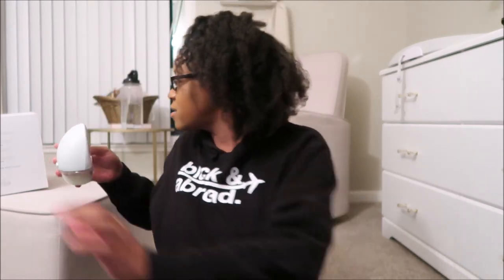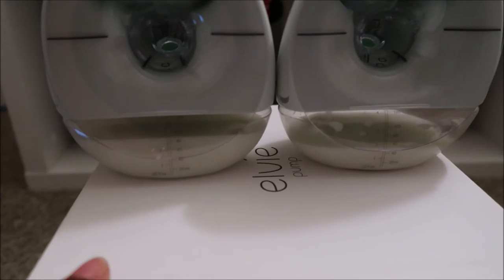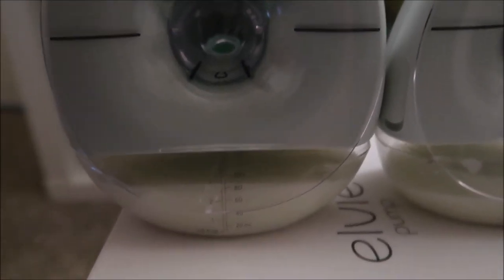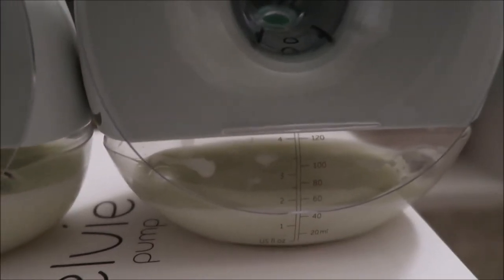I want to look and see if it was accurate — I'll set this flat. Actually a little off, which is interesting. This was on my right side and this is my left side. As you can see, that looks like almost three. And this one is almost two.